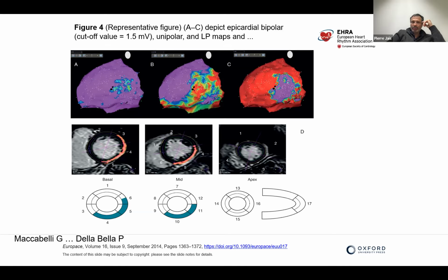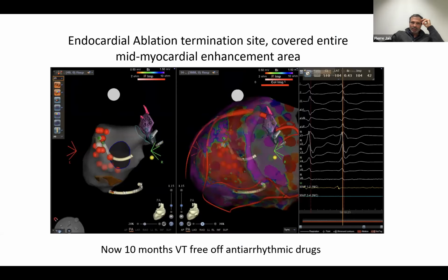My understanding from the work by Katja Zeppenfeld is that with a surviving ring of tissue, you only need 2 millimeters of surviving tissue between the electrode and the scar to give you a normal voltage, or at least not to qualify as scar with current criteria. I have the feeling that having some pre-processed imaging is very, very helpful.